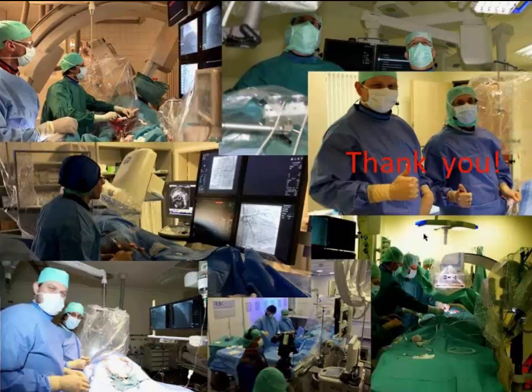When we are too deep with the microcatheter and then we flush, with a tiny CC1 or 0 epicardial, even the flush can destroy the epicardial. So we have to do it very gently. Stay a little bit more distal, a few millimeters away, and do a gentle injection. But for me, the deep injection is very useful because I understand the morphology, and for passage it's important.